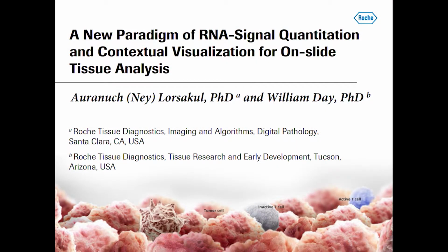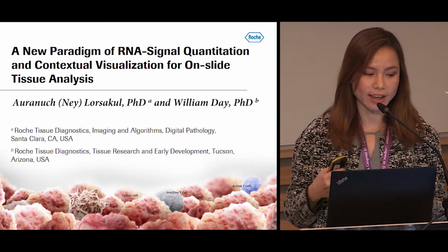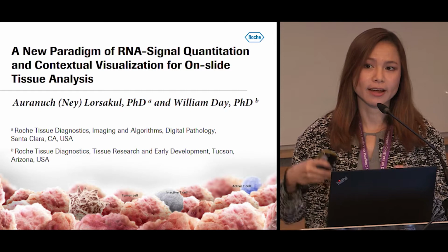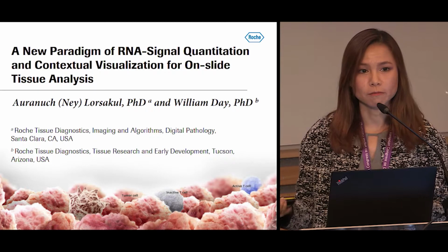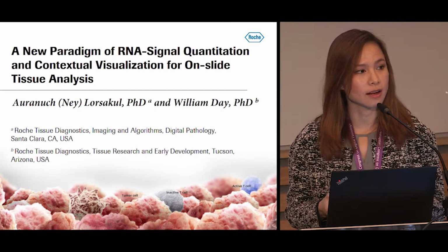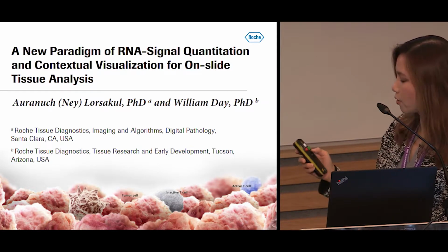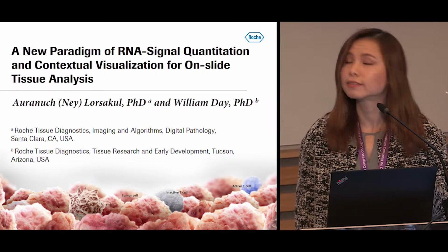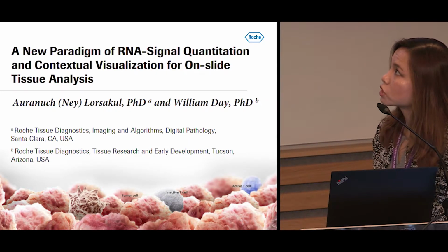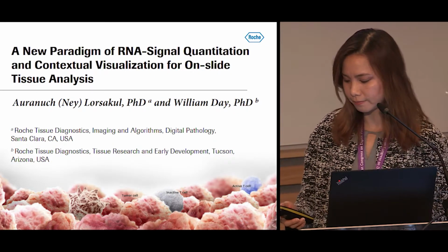This work focuses on the development of an algorithm that can be used to quantify the information of the RNA signal. Specifically, we can analyze this information on a glass slide. We still preserve the information of the tissue context, which is different from RNA sequencing. This work is a collaboration between the imaging and algorithms team in Santa Clara, California, and the tissue research and early development (TRED) team in Tucson, Arizona.